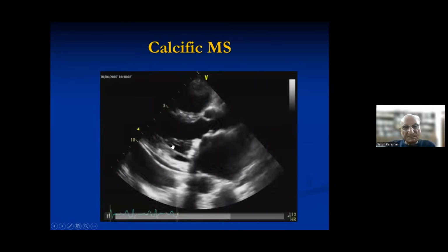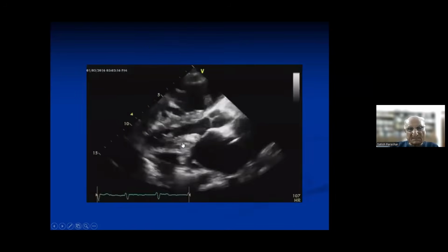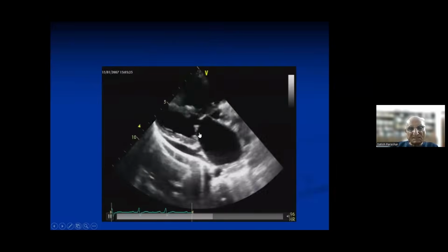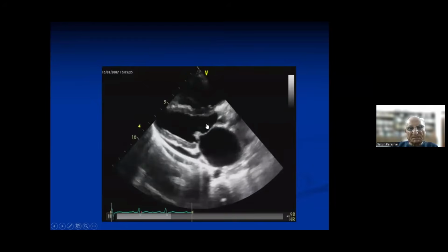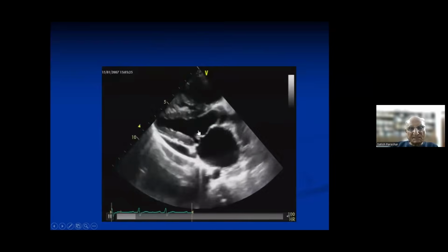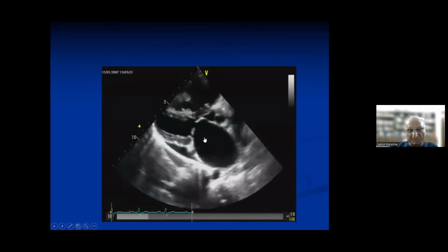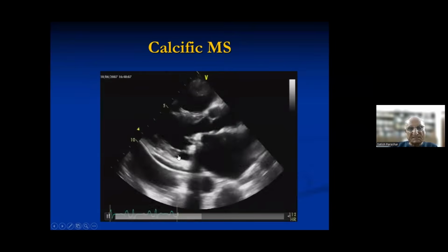And here you see it's a calcified valve. Remember that doming is a sign of mobility. Why does the doming occur? The leaflets are fixed at the annulus and the tips are fixed because of disease. So the only thing which moves is the body of the mitral leaflet. The base cannot move, the tip is restricted because of the disease. So as the disease becomes more severe, the doming may disappear. Here you see doming still there, but here hardly any doming.